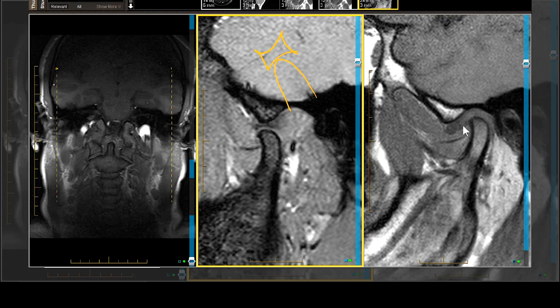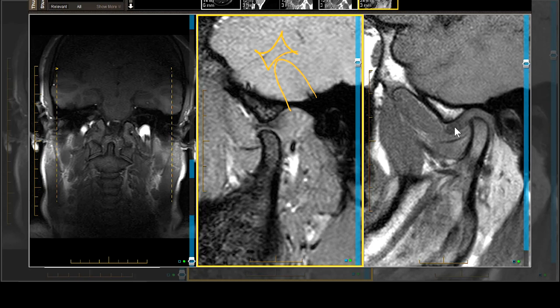There are three teaching points. The first: partial derangement with capture, as already illustrated. The second teaching point: in the closed mouth view, the posterior band is ill-defined because it's swollen, but what we can define is anterior to the twelve o'clock position of the mandibular condyle — see the prior vignette for establishing the twelve o'clock position in an anteverted condyle. The third teaching point: sometimes this tissue may become thick and scarred, and dark like the meniscus or disc.